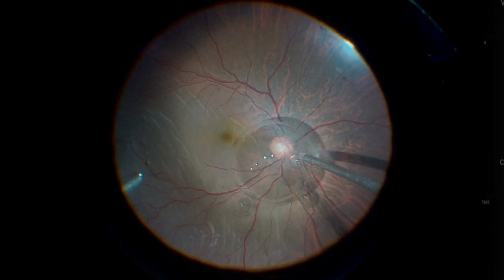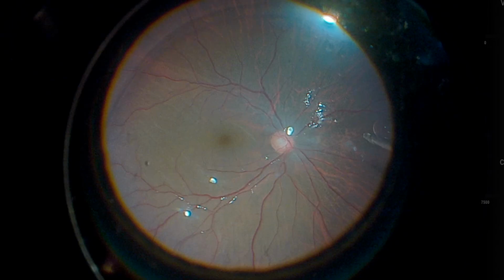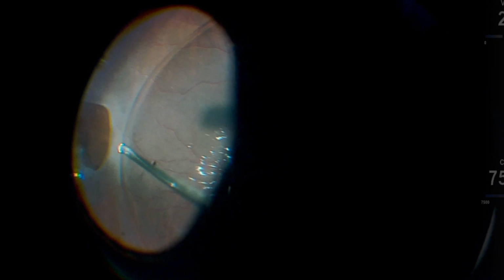The surgeon decides to use perfluorocarbon. This heavy liquid is useful in this type of surgery to both flatten the retina and drain the subretinal fluid, as well as to condense the peripheral vitreous base, facilitating its removal. This is especially useful in cases where the patient is still phakic, as in this surgery.